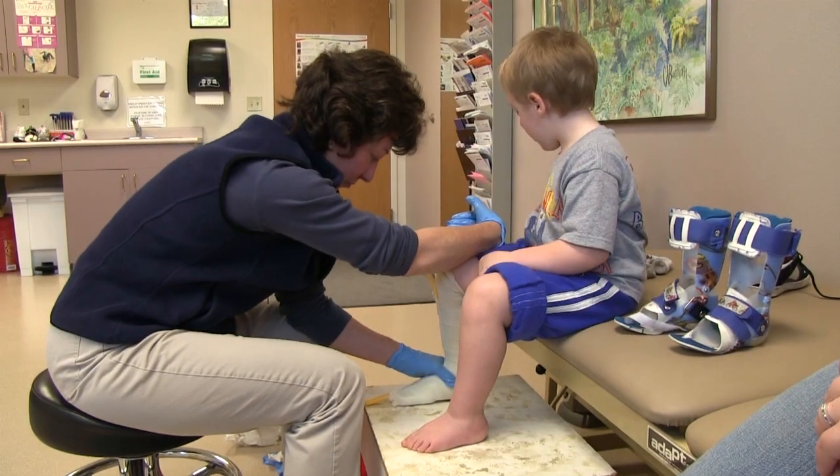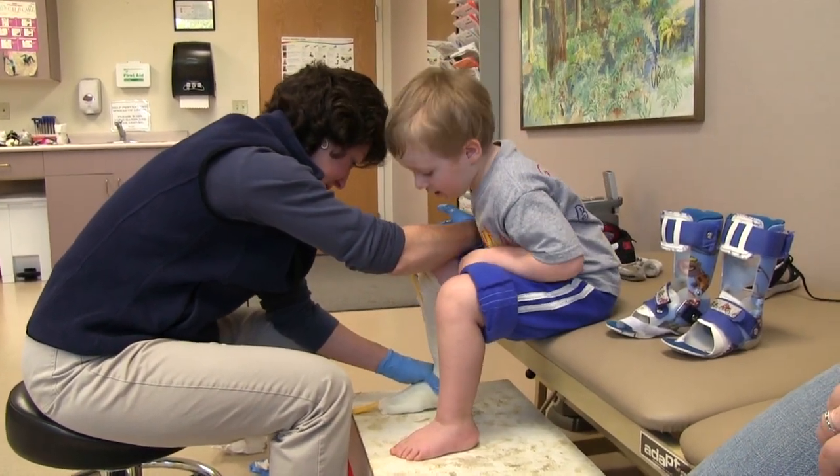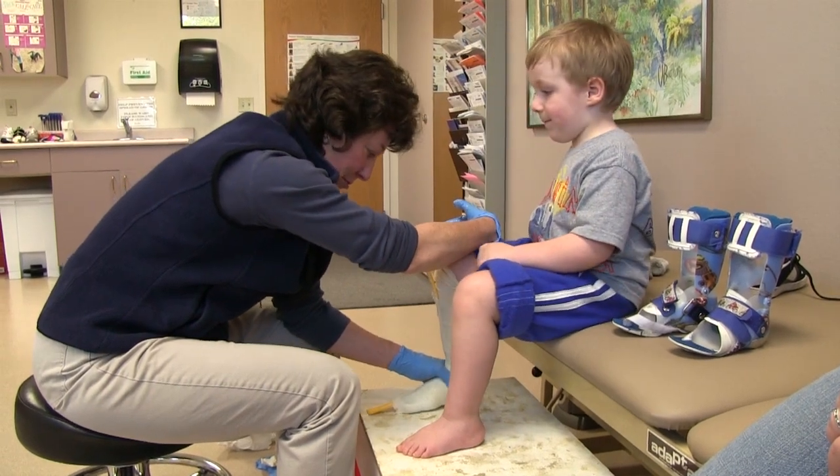But before we get started, one question you may be asking is: why do I still need a cast? There are two main reasons. One, most pediatric patients have a hard time sitting still for the length of time it takes to scan, and wiggly kids don't scan well.